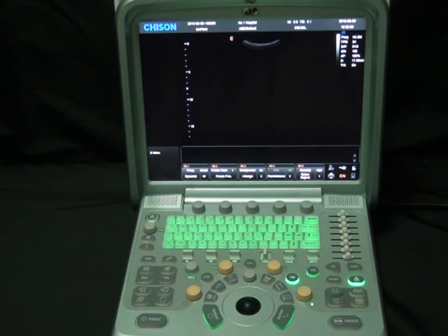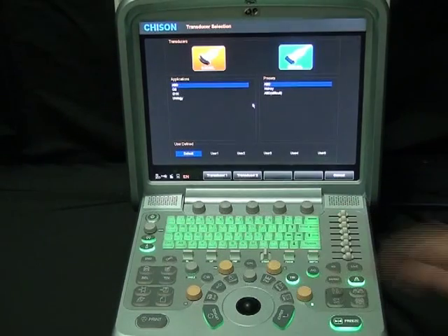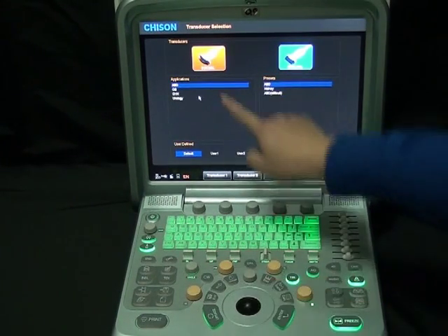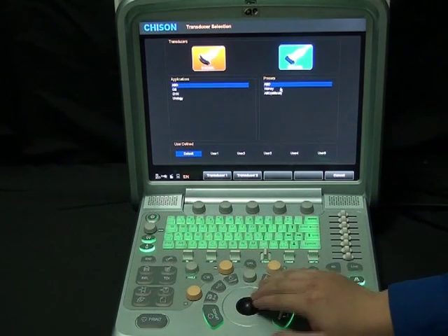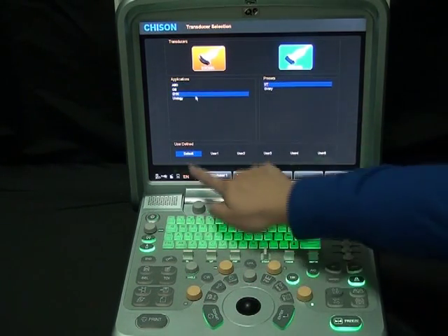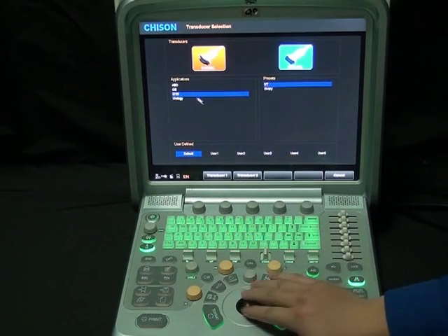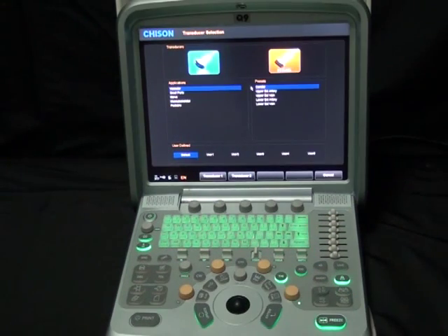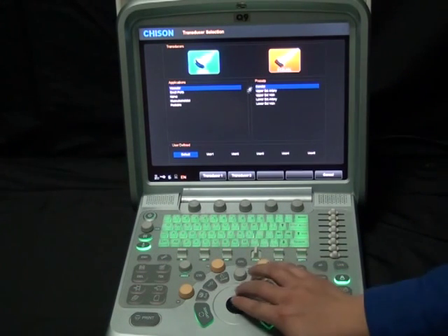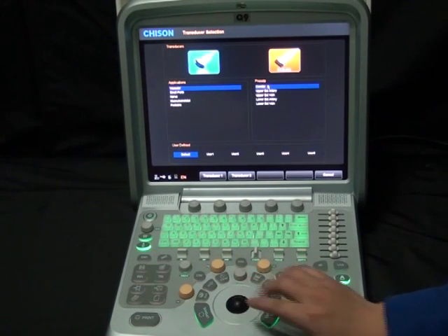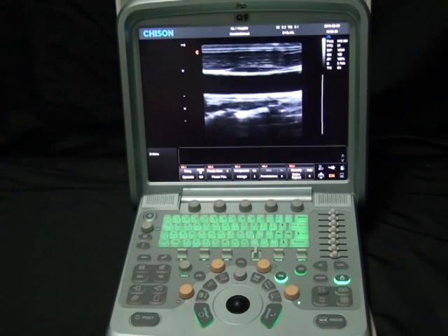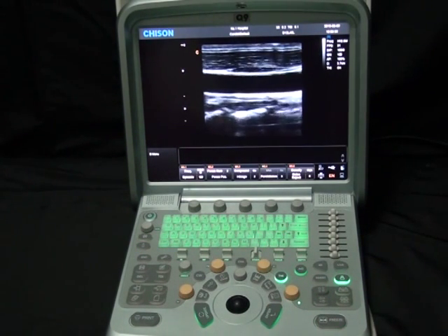Now to start the exam, we are going to select the probe icon. This is the main exam menu — two probes are available. Each probe has several applications, and each application has several presets. This is also where custom presets are shown. We are going to choose the linear probe, vascular application, and carotid preset. Double-click carotid to enter the scanning interface. Now we are in B mode.